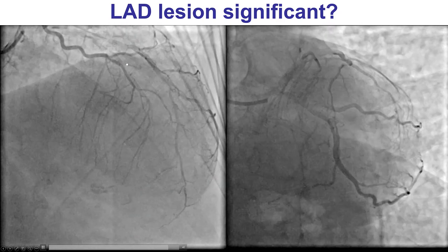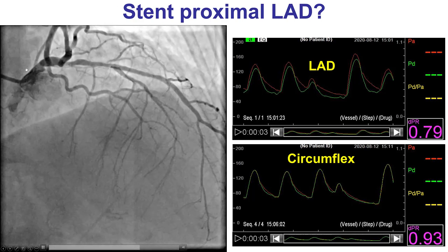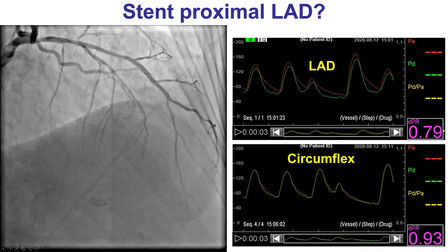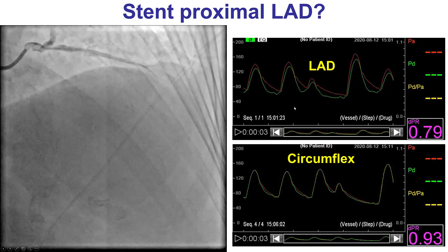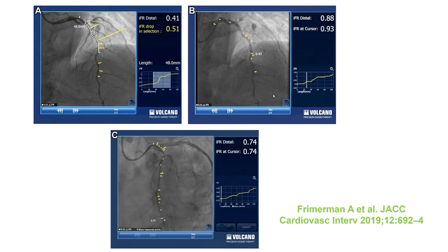This is another example of an LAD with some diffuse disease that doesn't appear severe angiographically. However, the non-hyperemic DPR index is 0.79 — clearly ischemic — whereas the circumflex is normal. On pullback, there is a gradual pressure increase with no focal disease, so stenting is unlikely to be useful, and the patient was referred for coronary bypass. Some systems have a coregistration feature displaying areas of pressure drop along the angiogram to facilitate PCI planning.